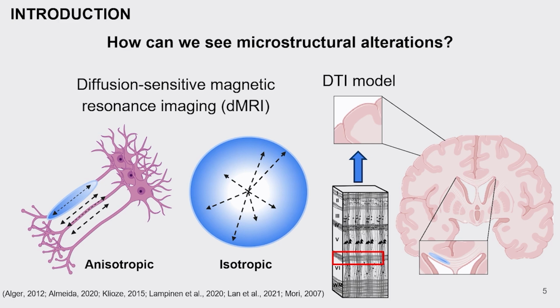So the DTI model yields nearly isotropic diffusion. That's why we wanted to go a little further, examining distributions of tensors, not to derive one or two, but thousands. We may not be able to visualize so many tensors, but we can talk about their distribution.